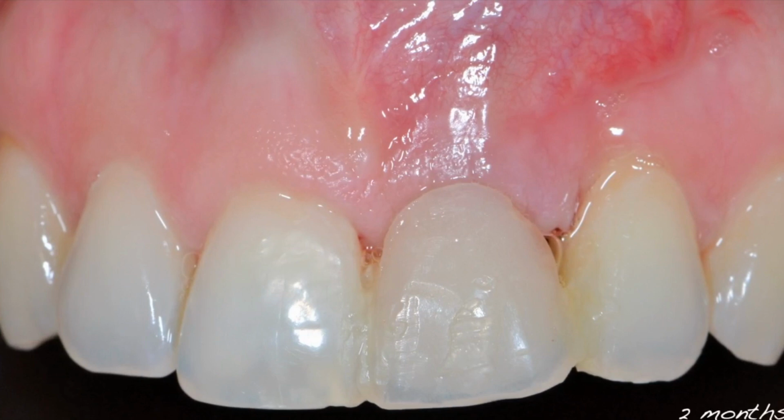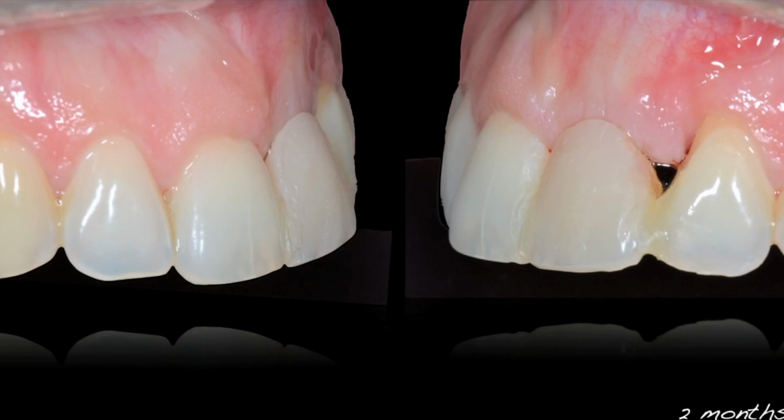had the provisional tooth bonded to the adjacent teeth, so no pressure was done on the flap. We allowed, of course, more time for the healing, about 5 months, as I said previously. This is the profile shots, as you can see, distal and mesial. You can discern some deformity on the buccal plate, but it has been restored.